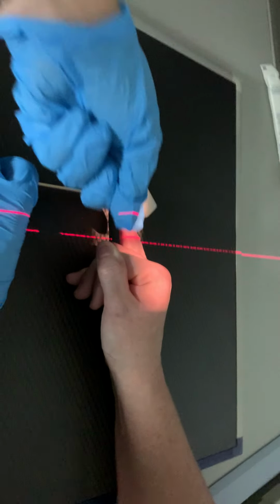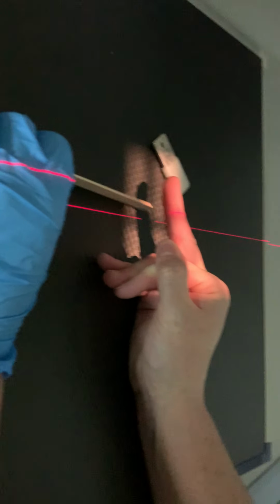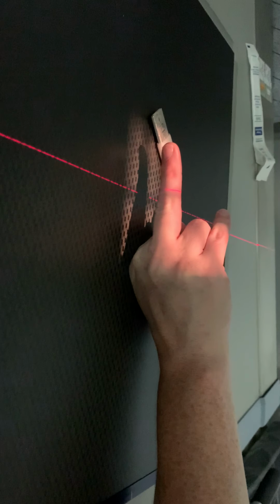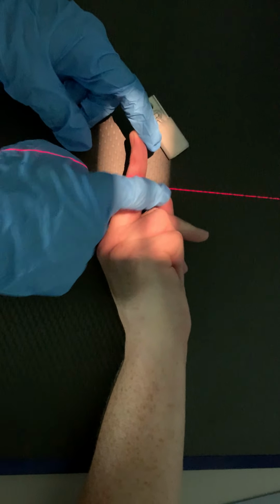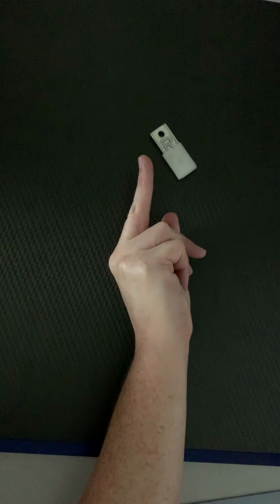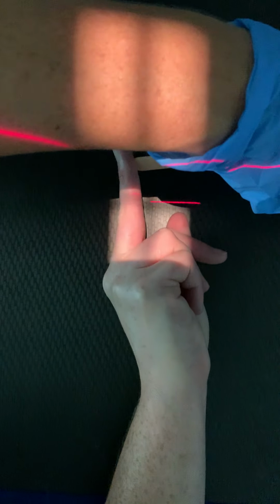Now let's do 3rd. So 3rd, what we'll have to do with 3rd is because there's so much OID here, can you flip your hand over? So 2nd and 3rd digits are better to flip the hand over to get them closer to the IR. Here's the thing. We still got all these other fingers in the way, don't we? So in certain situations, you may have to use the tape to tape these other fingers out of the way. She's doing a pretty good job here. She won't be able to hold this tongue depressor though to push that finger out.